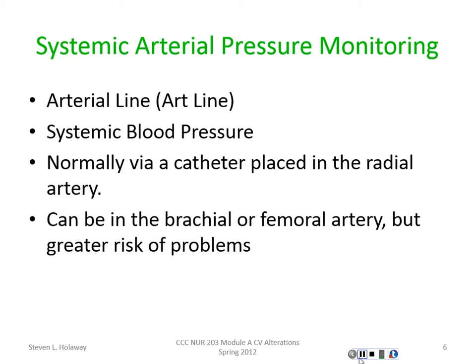Same thing if I've got it in the femoral area, I need to be checking distal to that, looking at the circulation for those areas. Have y'all heard about the Allen's test?